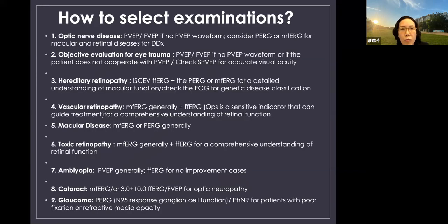As I mentioned, we have a lot of electrophysiology modalities. When we face a patient, we should know what kind of examinations we need to order for this patient. So we need to know what's the difference between VEP, ERG, and so on. I will give a short summary for typical cases.